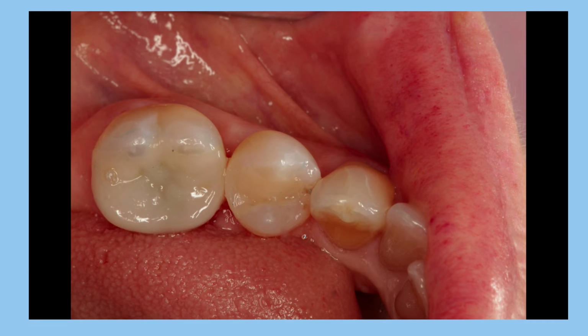The onlay is a porcelain or ceramic e.max restoration, and it's bonded biomimetically to the tooth, and you get a nice result where a good portion of the enamel has been preserved, the crack was eliminated, and hopefully it never needs to have a root canal. Hopefully it never needs to have a crown, and it would be nice if this onlay restoration is the last time this tooth is restored.